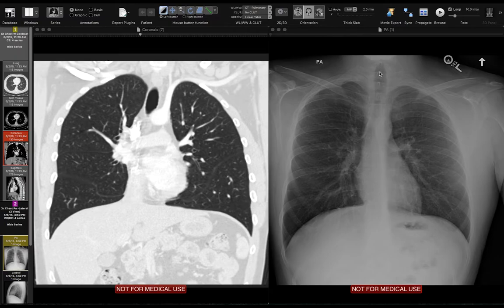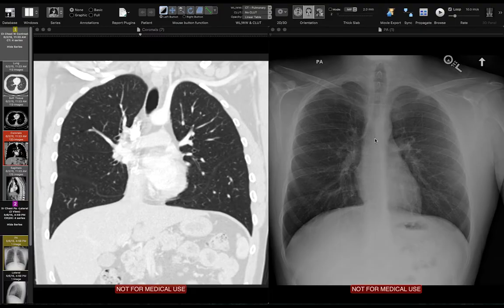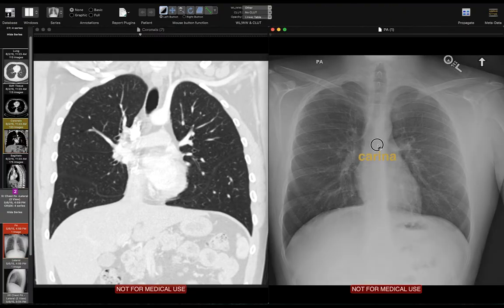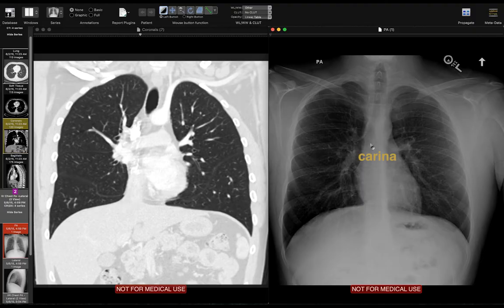The first thing that I look at is the trachea. The trachea is a midline lucent structure, and you can see that it's normally deviated slightly to the right because of the left-sided aortic arch — it causes that slight shift of the trachea to the right. The trachea ends right here in this triangular-shaped carina.